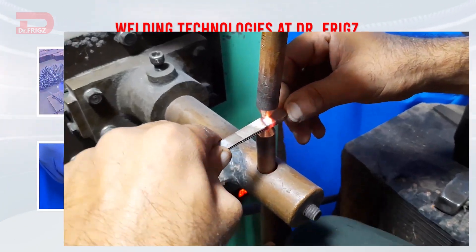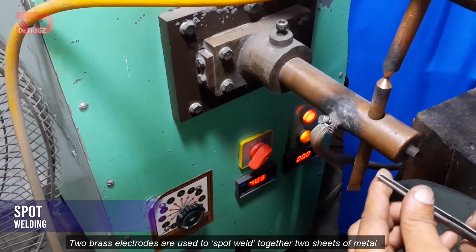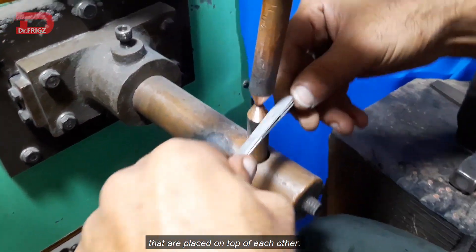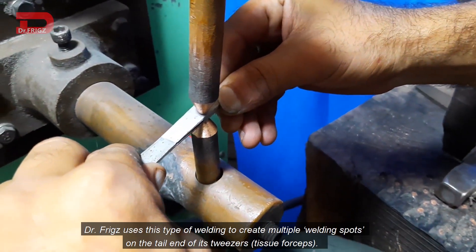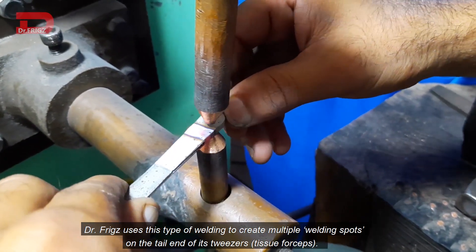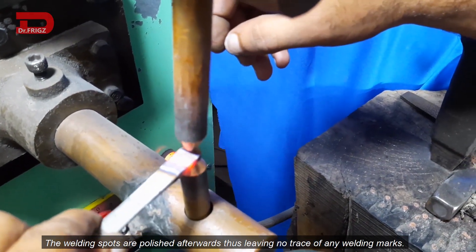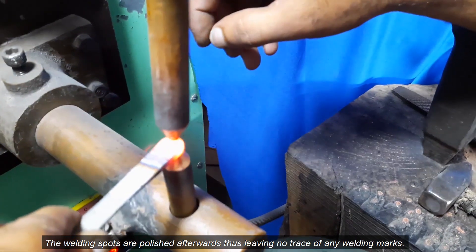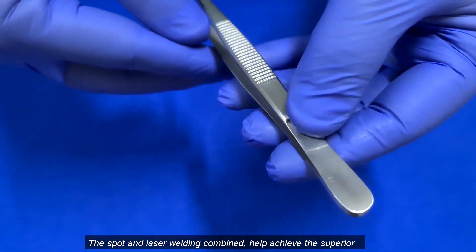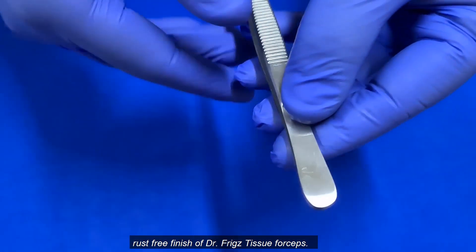Spot welding. This is a form of electric resistance welding. Two brass electrodes are used to spot weld together two sheets of metal that are placed on top of each other. Dr. Friggs uses this type of welding to create multiple welding spots on the tail end of the tweezers or the tissue forceps. The welding spots are polished afterwards, thus leaving no trace of any welding marks. The spot and laser welding combined help achieve the superior rust-free finish of Dr. Friggs' tissue forceps.